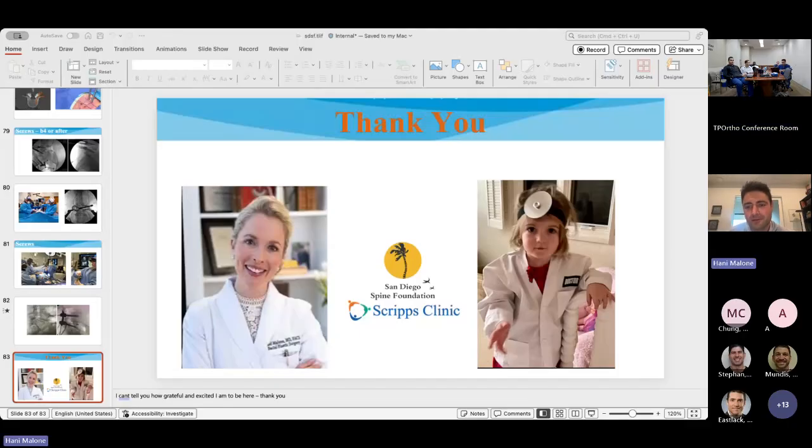AJ, it kind of stinks for AJ. The first one that we did, the guy's BMI was literally 50. For whatever reason, a 7-centimeter tube is pretty reasonable, but as soon as you get to 8 or God forbid 9, it gets really hard. I think the reason is the drill and all the instruments, once you get past 7 centimeters, they're not designed for that. So you're like writing an essay holding the pencil by its eraser. You have to choke so far back on everything that it's really hard to get good control. But he did a good job.